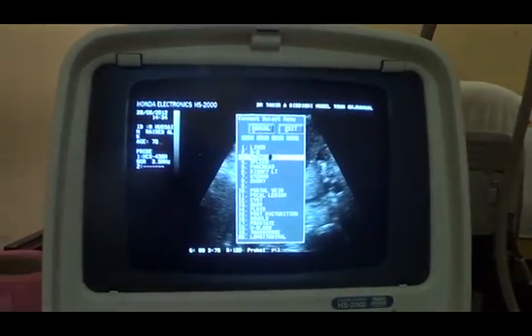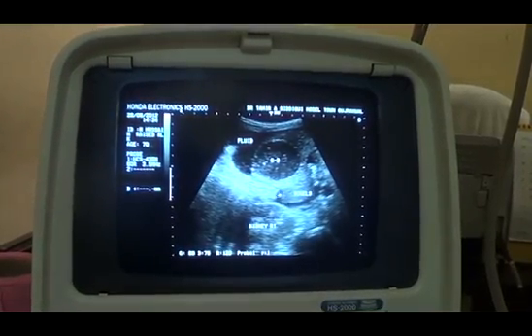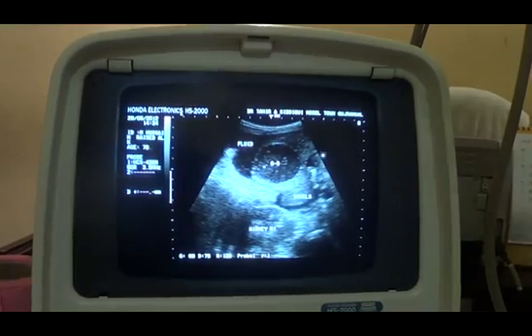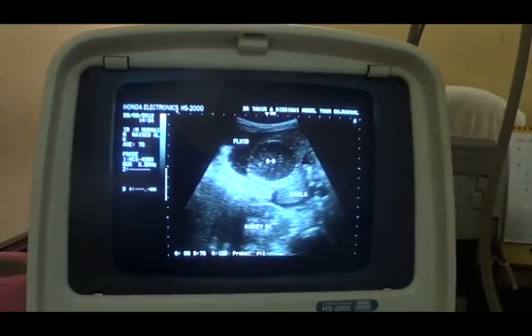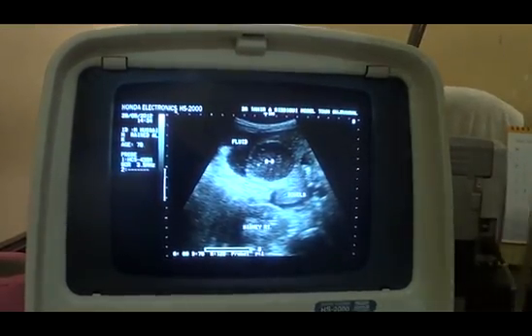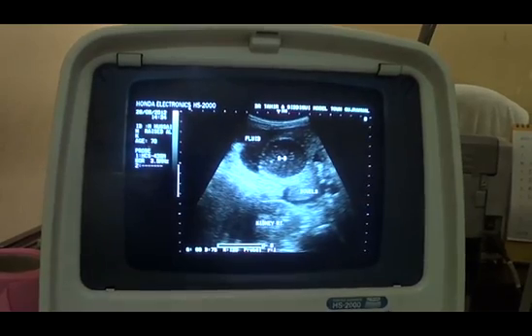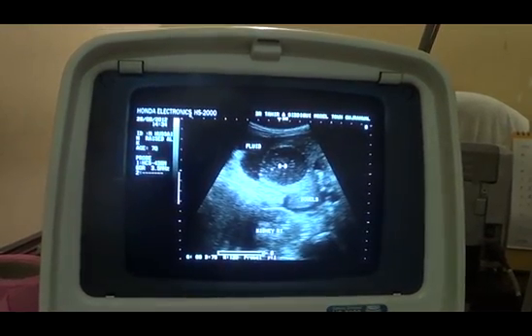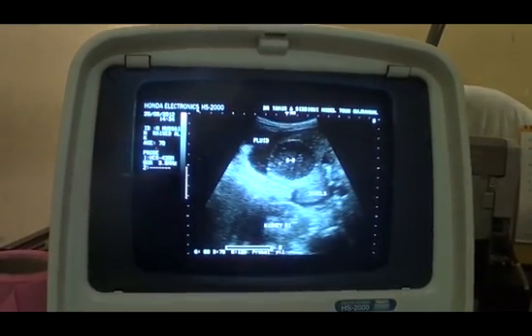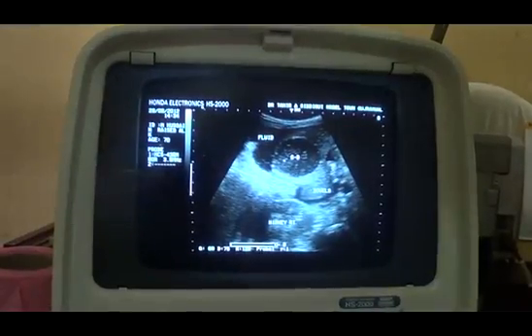This is the right kidney in transverse section. And this black area is all fluid in the Morrison's pouch. This is the loculated fluid pocket. So, in fact, the pathology relates basically to the gallbladder and the loculated fluid pocket around it, the cause of jaundice and all the other findings that we are seeing. Now, this is all that we can provide by ultrasound. And in this case, CT scan with contrast is ideally recommended. Thank you.